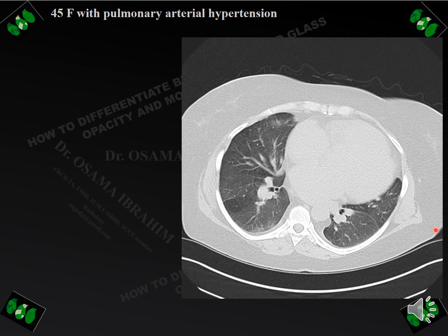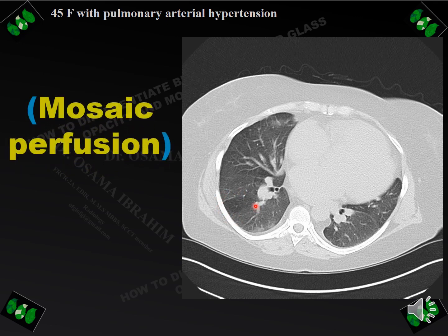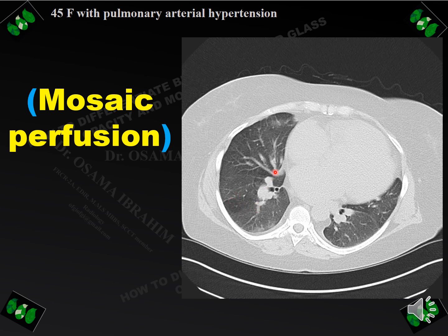On this HRCT there are areas of low attenuation and also areas of high attenuation. The question is: is the low attenuation area abnormal or is the high attenuation area abnormal? Looking at the blood vessels within both areas, the blood vessels in the high attenuation area are larger and greater in number and size compared with the blood vessels in the low attenuation area. So the diagnosis is abnormal low attenuation, which means mosaic perfusion. This patient was a 45-year-old female with pulmonary arterial hypertension.